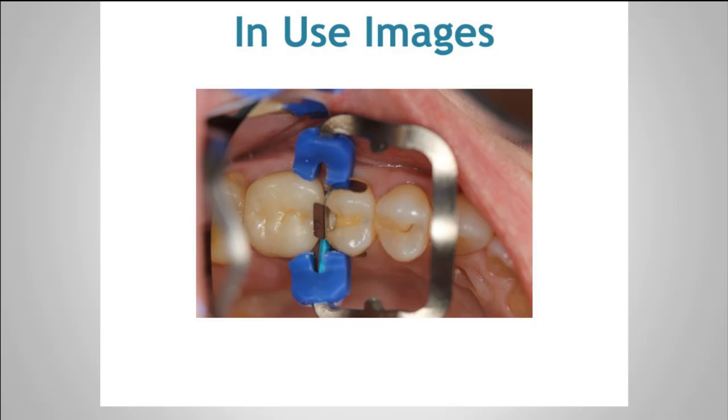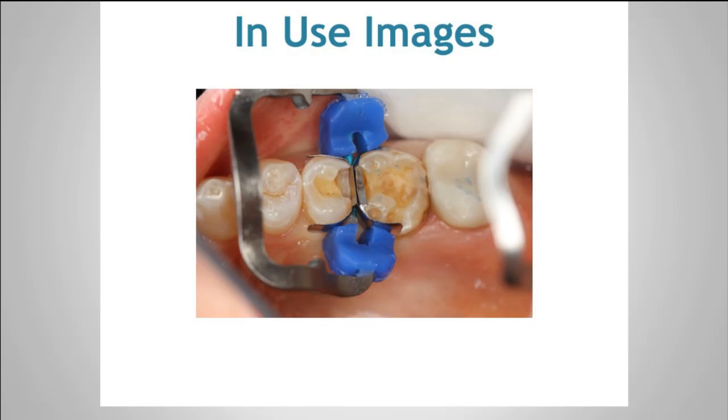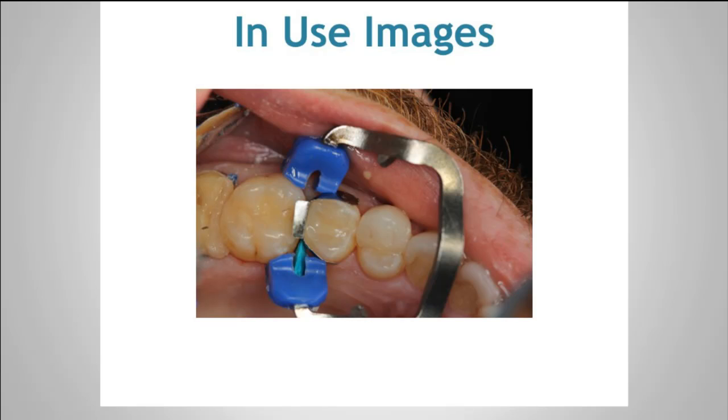So make sure when you're placing, you're able to see, on a buccal-lingual direction, the overall placement being down below the height of contour on the gingival tissue. If you take a look at that image, you can certainly see how well adapted that is on the buccal and the lingual. Here's a back-to-back type situation where we were able to get some really nice contact points, and you can see the lack of flash and the overall seal that's really nicely achieved. Very wide visibility. Had my dry tip back there, as you can see in the corner, pulling that cheek back, but it really does a nice job in overall isolation.